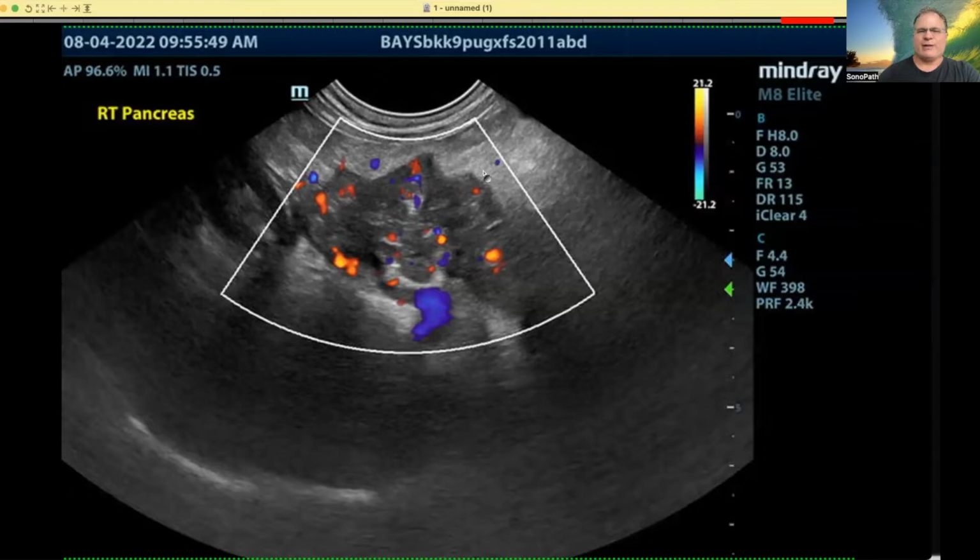We have a lot of fuzzy fat or reactive mesentery upon it, so we know this is a clinical issue. It's pretty hot from the vascularity there. This is the pancreatoduodenal vein coming in, or pancreatoduodenal vein to the gastroduodenal vein. It goes towards a portal, and so we can see all of this hot pathology here. Okay, so this would be enough to make any animal clinical by itself, but we have lots more to look at.